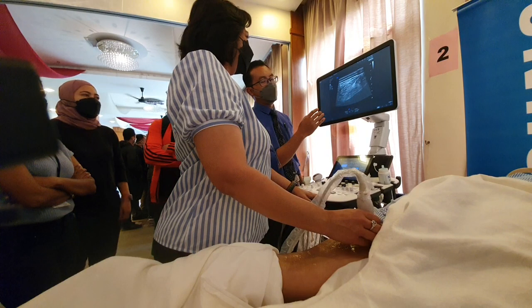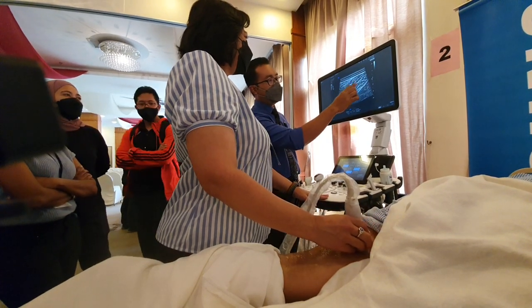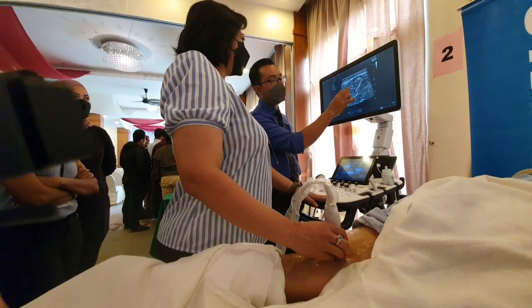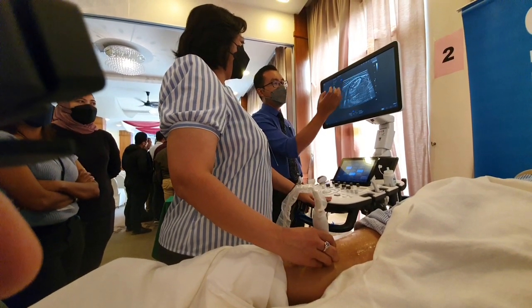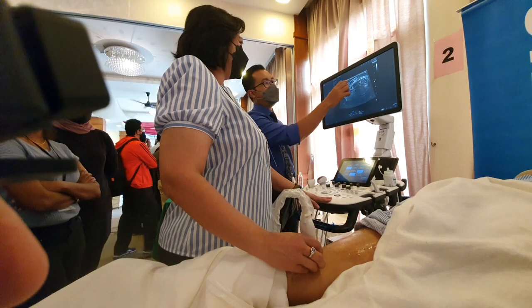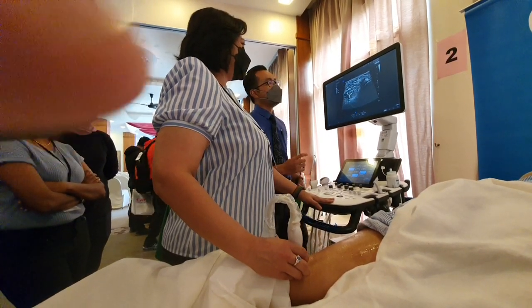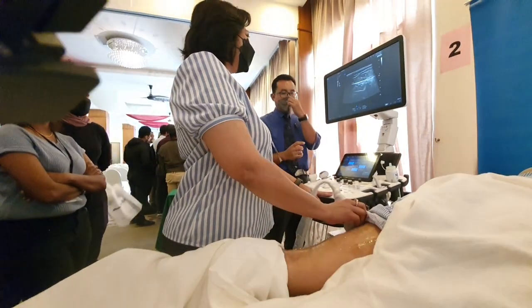Okay, so let's say you see a tear here. So you want to determine what muscle. Yeah, because it becomes a tendon. See, this one is the same.